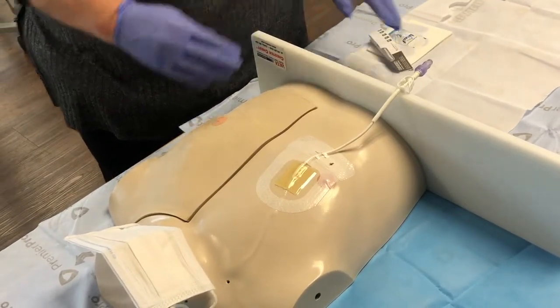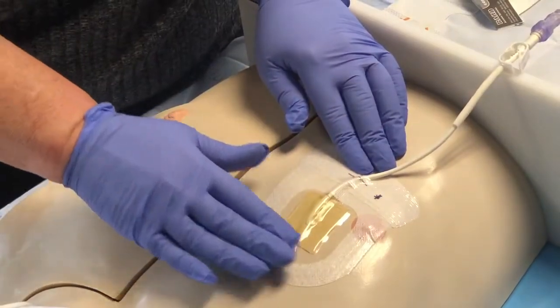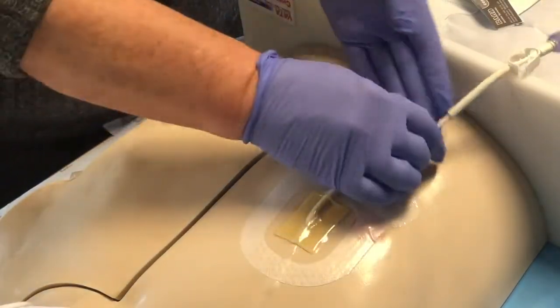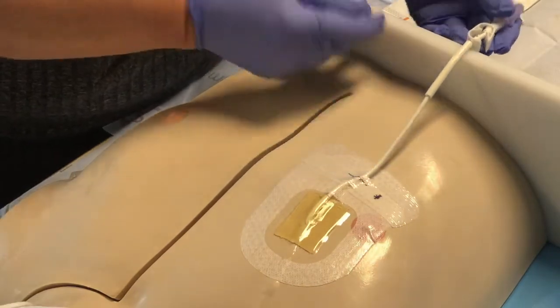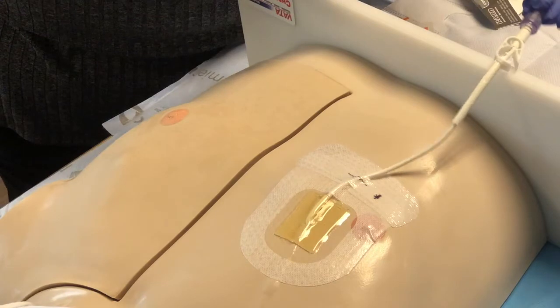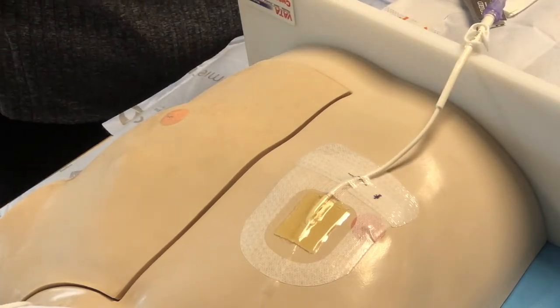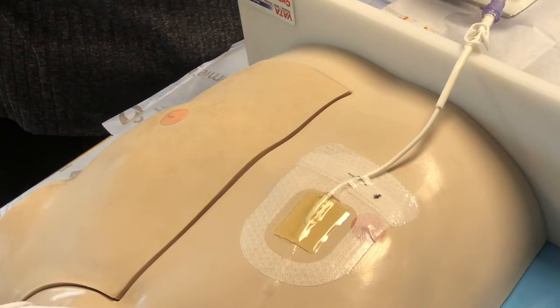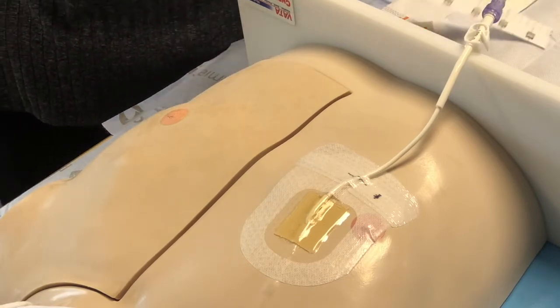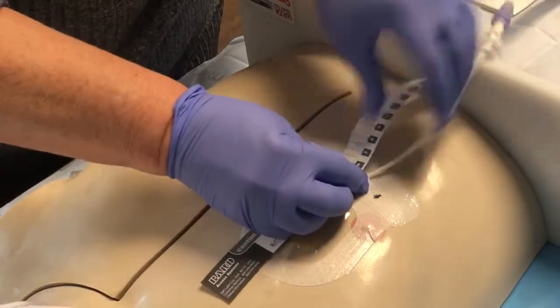Examine the dressing, catheter, palpate, and ask the patient about drainage, purulence, redness, swelling, fluctuance, bleeding, catheter integrity, warmth, and pain. Using the measuring tape in the kit, measure the external length of the catheter and compare it to the documented length.